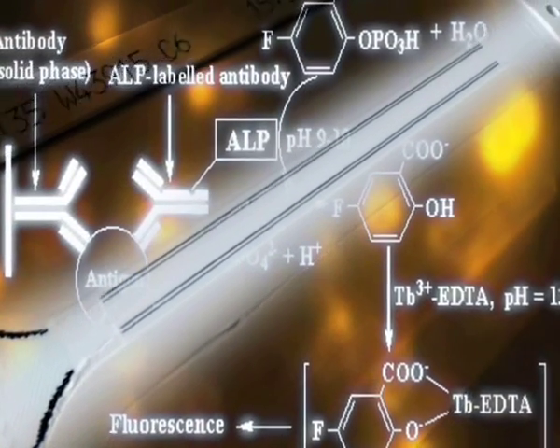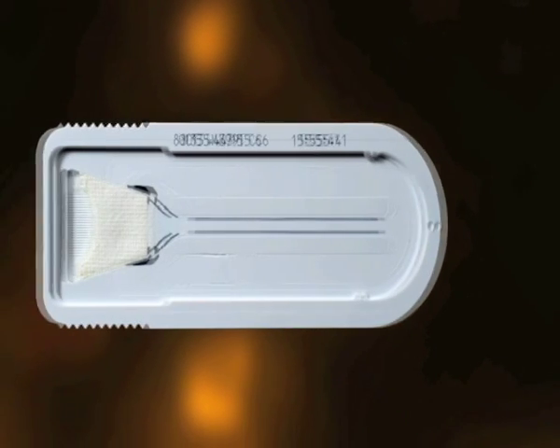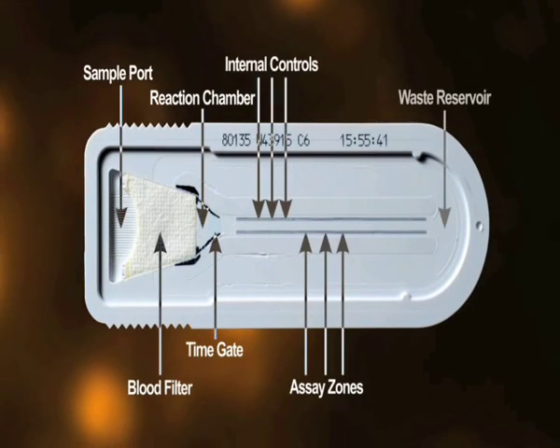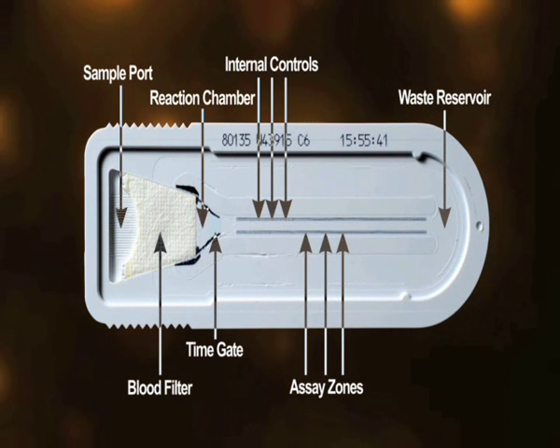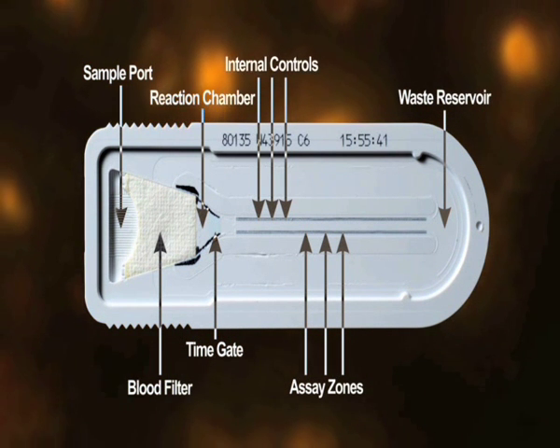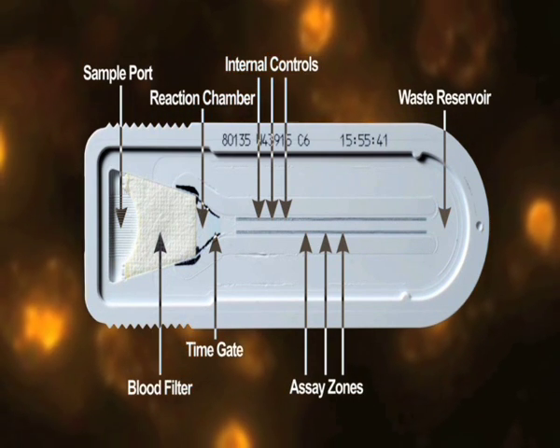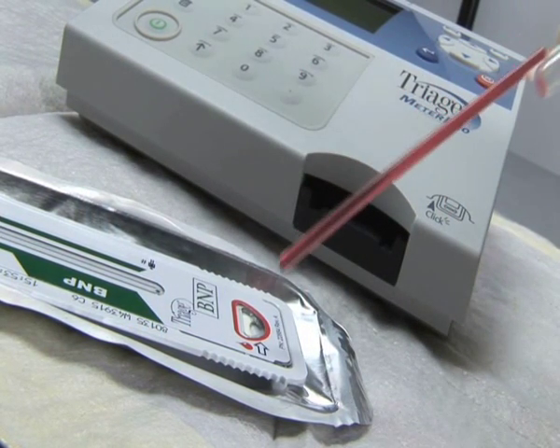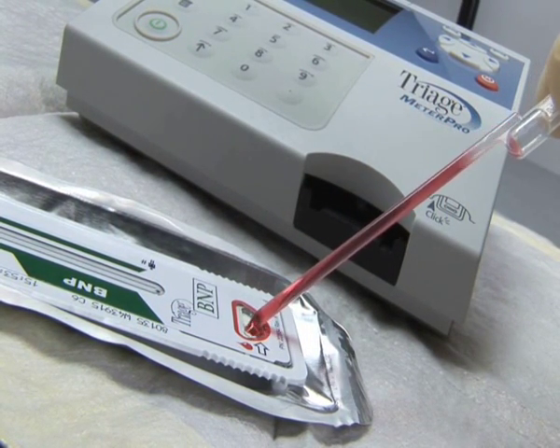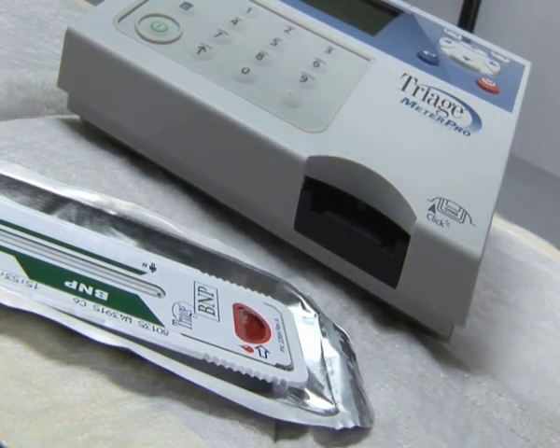allow the immunoassay to be performed in about 15 minutes with very few procedural steps. The design of the test devices allows for precisely timed reactions to take place on predetermined immunoassay zones, where the meter detects fluorescence and converts that reading into a concentration for each analyte. This process begins as soon as the blood or plasma sample is added to the sample port, using the pre-measured pipettes provided with the triage kit.